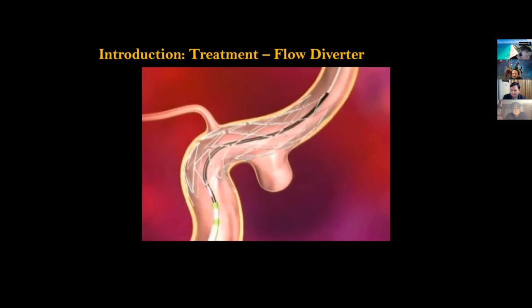If you go with a 3 millimeter device for a 3.5 millimeter diameter, then you have to crunch it together, kind of push into the device. And what's going to happen, you're going to have a higher density of metal over the aneurysm neck and divert more. The issue with undersizing and crunching it together is that if you're not careful when you push onto the device, you will end up buckling it into the aneurysm neck. So it requires a lot of finesse for the neurosurgeons to feel the pressures in the catheters and the backflow to avoid this kind of complication.